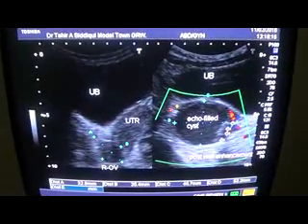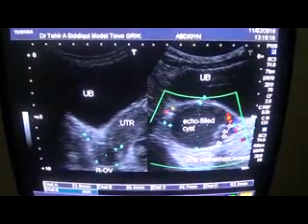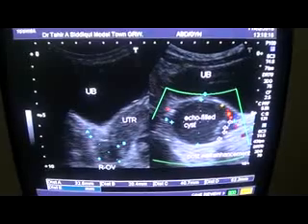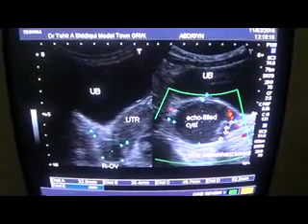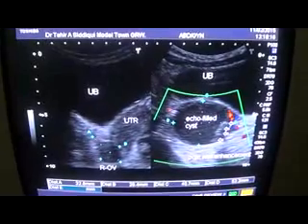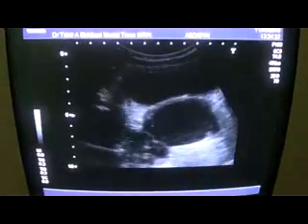So far as the vascularity is concerned, the edge margin is vascular. Here you see, this is the vascular margin. Internally there is no evidence of blood flow, and you see the strong back wall, sharp back wall is seen. Now let's do it in real time.